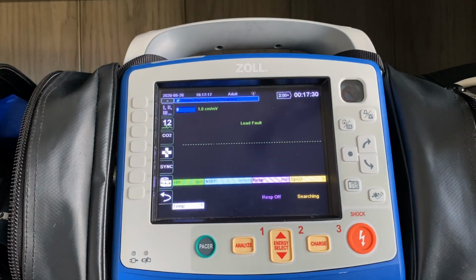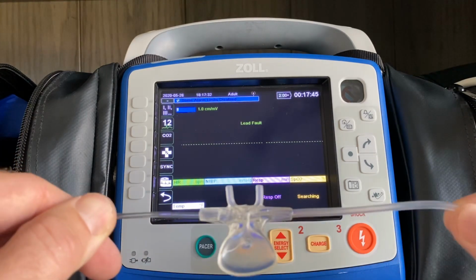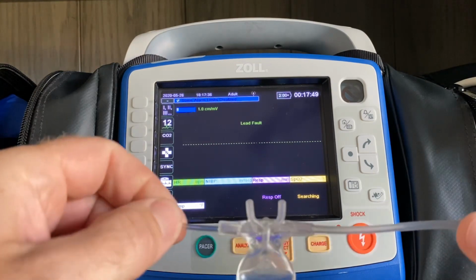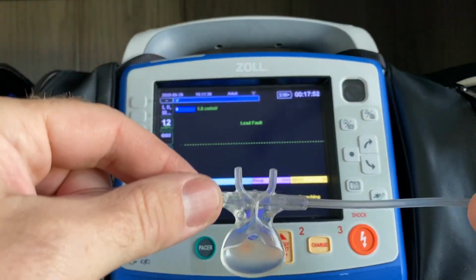That develops a cloud of oxygen around their mouth and nose, which clinically speaking is a more effective way of delivering oxygen to that patient, because if they're breathing heavy out of their nose or mouth, you're going to provide oxygen to them either way. The way this disposable piece is set up allows, again, for a heavy mouth breather or nose breather to have the values recorded either way.